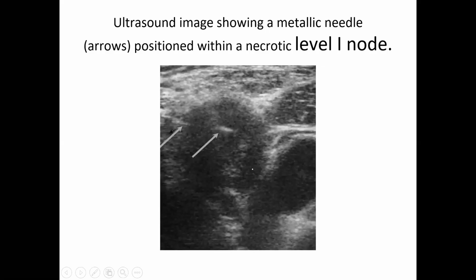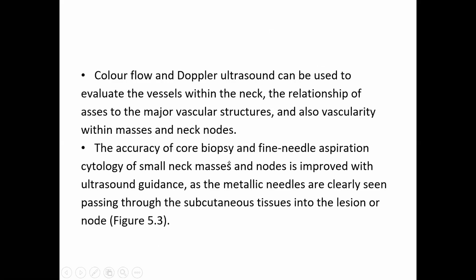Ultrasound, once again, if you are able to see here, the ultrasound image showing a metallic needle positioned within the necrotic level 1 node. So this is where you are going to do the ultrasound with the help of FNAC, ultrasound guided FNAC. You could see in these arrows the ultrasound guided FNAC. Next.